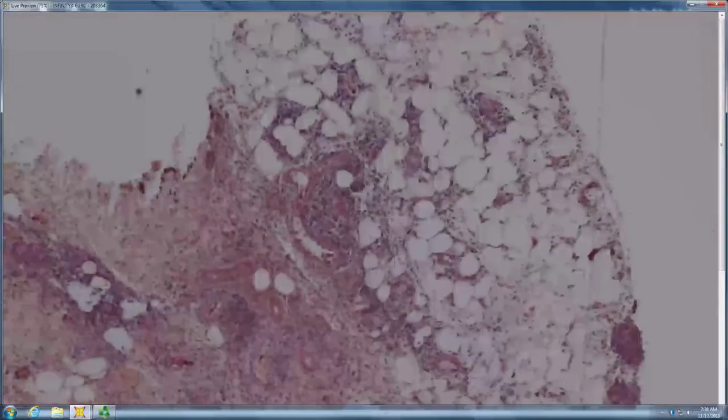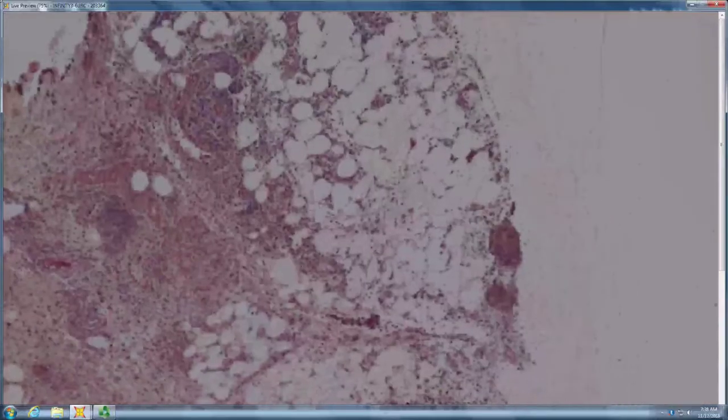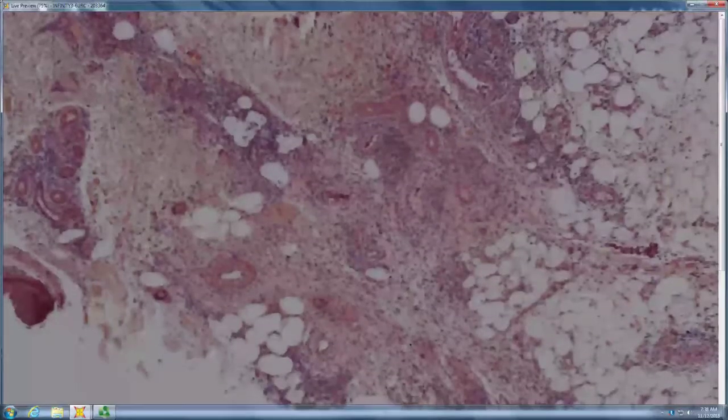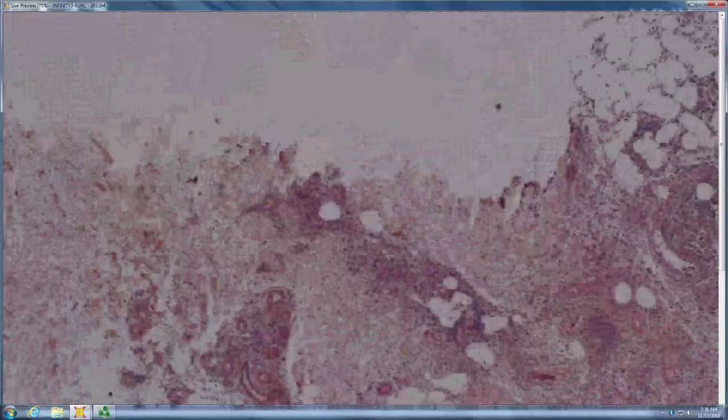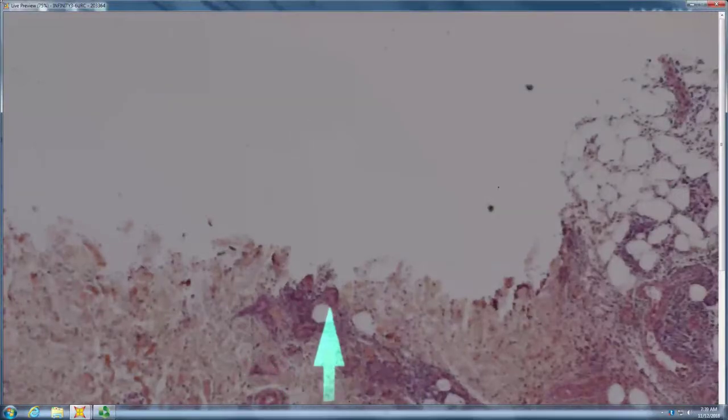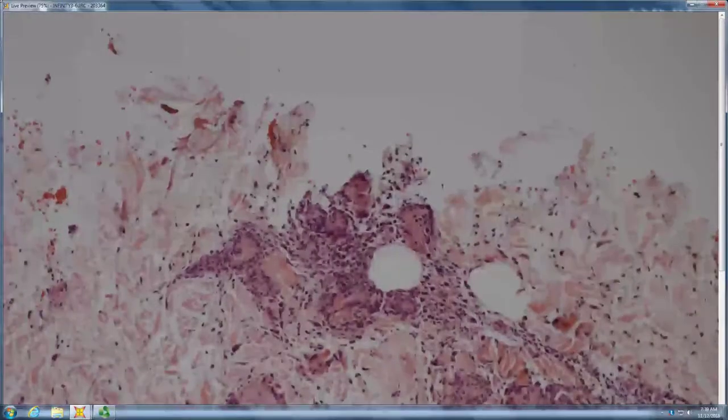So it looks like we've got a lot of inflammation somewhere on the eccrine coil. And what kind of inflammation? Lobular. Oh, sorry. Like lymphocytic. Are these lymphocytes? I don't think I can really tell from here. Maybe let's go one higher. Multinucleated cells. Yeah, like giant cells. That's what I see. So you definitely have some granuloma there.